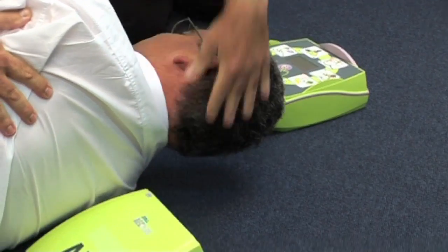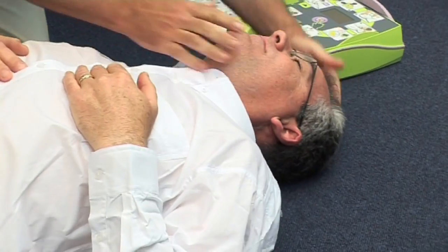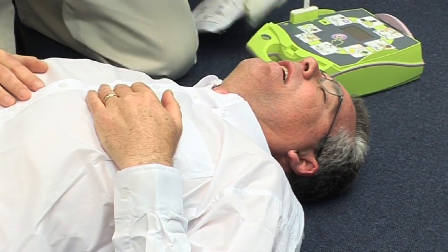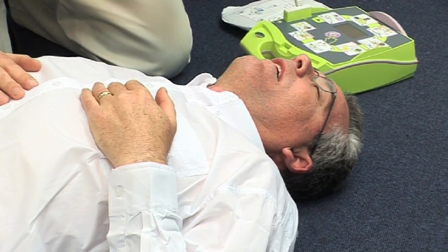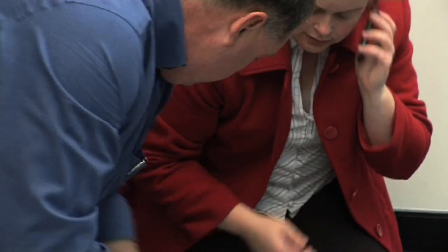The next step is to lift the chin and tilt the head back to open the airway. Check breathing by looking at the chest to see if it is rising and falling. Listen and look for airflow exhalation. If the person is not breathing, then follow the AED Plus instructions.